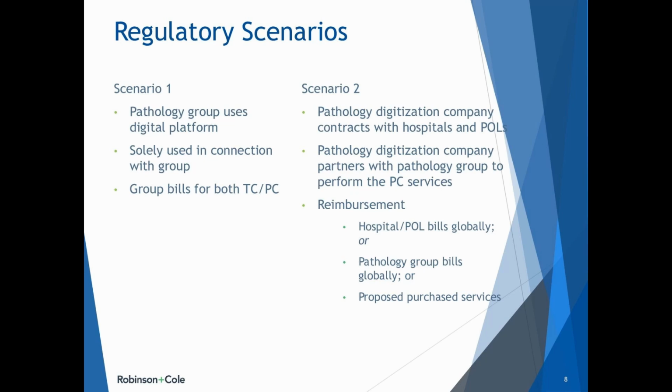Particularly, with the in-office ancillary service exception, you have to give thought to the prong about where the service is furnished and whether you meet all of the exceptions. And so that's a really important conversation to have with your counsel. And then you still have to consider all the CAP and CLIA considerations we've talked about.